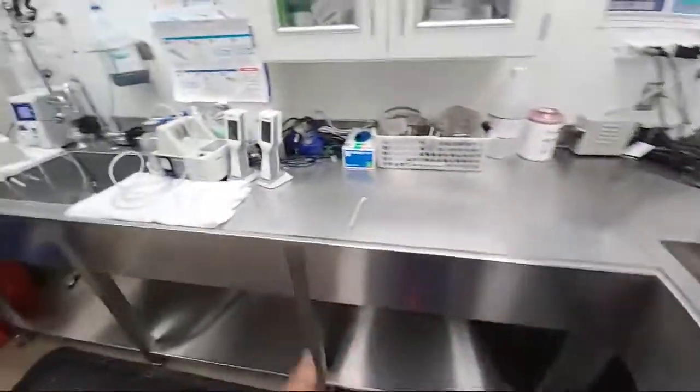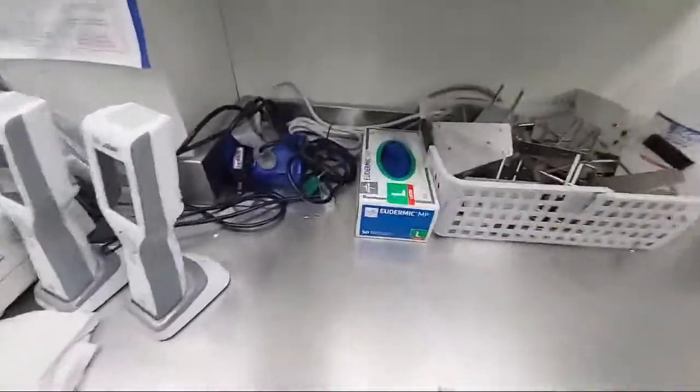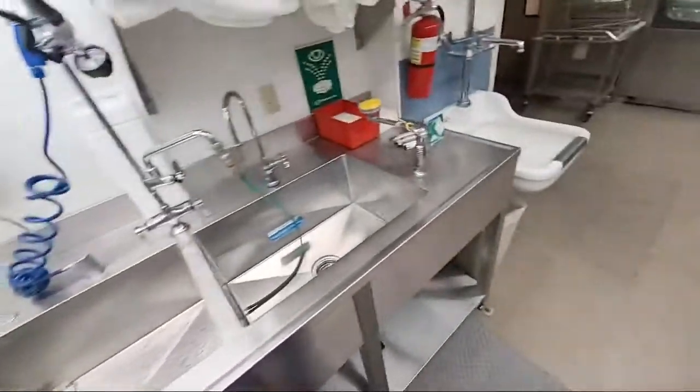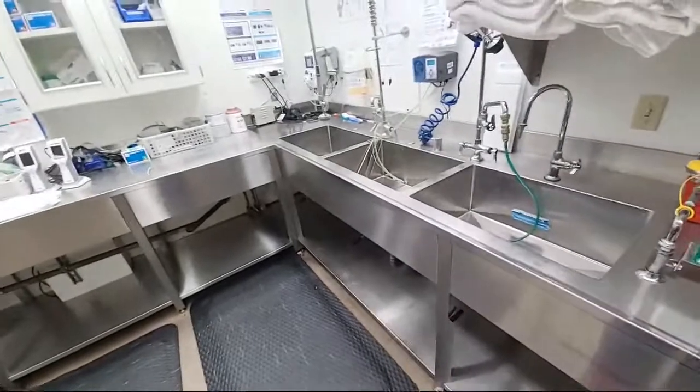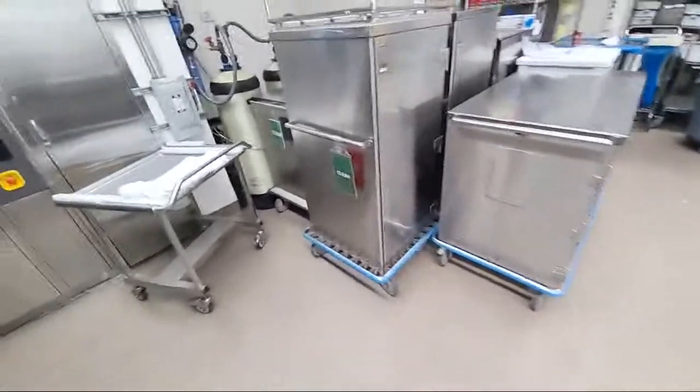Notice I'm not touching anything here. I've already cleaned and washed my hands. They're the special gloves we use. They're not like the normal gloves for everywhere else. They're a little thicker, a little tougher. They are a little resistant to some of the poking when you get hit by needles or whatnot on your hands. I've noticed it doesn't tear quite as easily.